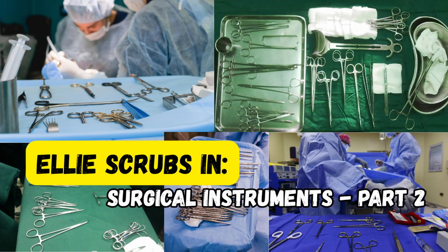Welcome back to Ellie Scrubs In. You're watching part two of our multi-part surgical instrument guide, where we break down the names, uses, and critical tips for the most important tools in open general surgery. If you joined us for part one, you've already met 10 core instruments. Today we'll introduce 10 more that are just as vital. Whether you're prepping for your first OR case or you've already scrubbed in a few times, this is your go-to crash course.